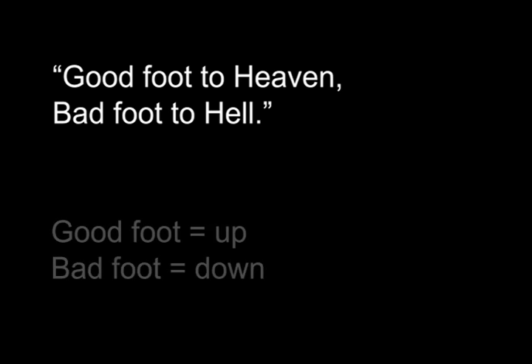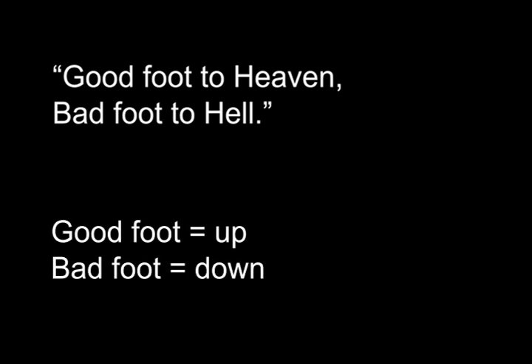To go up and down stairs, there is an old saying: good foot to heaven, bad foot to hell. That means that your good foot goes up onto the step first when stepping up, and your bad foot leads when stepping down.